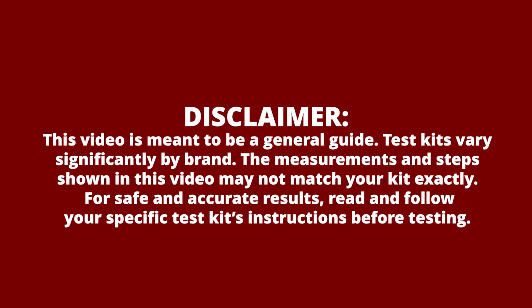Disclaimer: this video is meant to be a general guide. Test kits vary significantly by brand. The measurements and steps shown in this video may not match your kit exactly. For safe and accurate results, read and follow your specific test kit's instructions before testing.